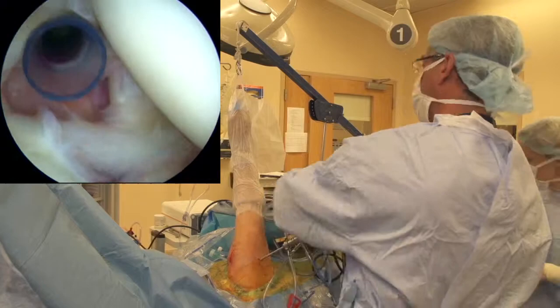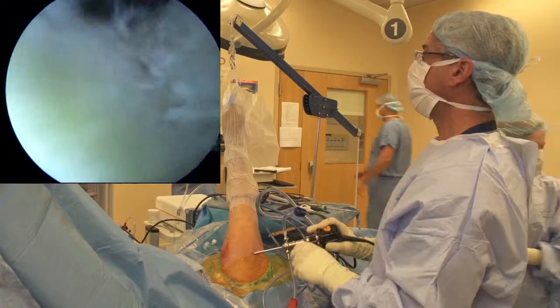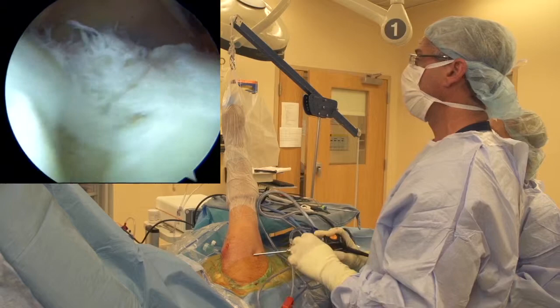The rest of the glenohumeral joint looks pretty good. So we'll go ahead and progress to the subacromial space and analyze our tear pattern. I've gone ahead and moved the scope up into the subacromial space. We can see we've got our fairly typical crescent-shaped supraspinatus rotator cuff tear. Here's our footprint, which is visualized reasonably well for us as well.